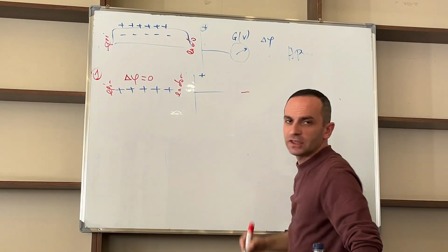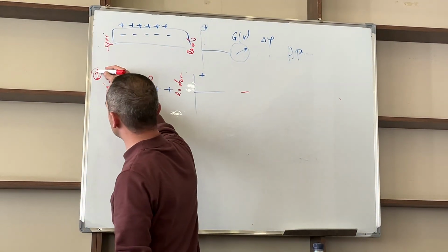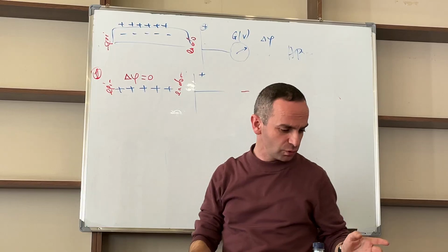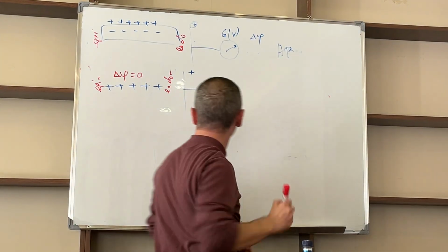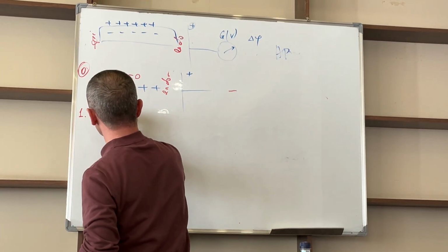Accordingly, here we have straight line. Like this is moment 0, just 0 moment from the start, or 1, doesn't matter. This is just symbolically we are writing, let it be 0. First moment starts depolarization.